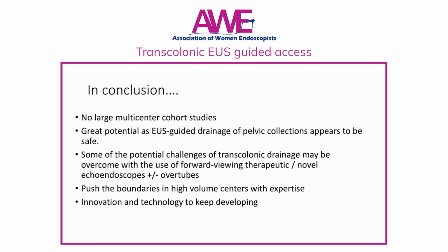So, in conclusion, ladies and gentlemen, you can see that there are no large multi-center cohort studies. Everything has been case reports and case series, and you can see the challenges with transcolonic EUS. I think we are quite convinced with transrectal approach, but I think there is great potential.